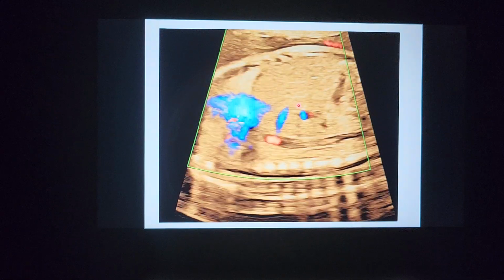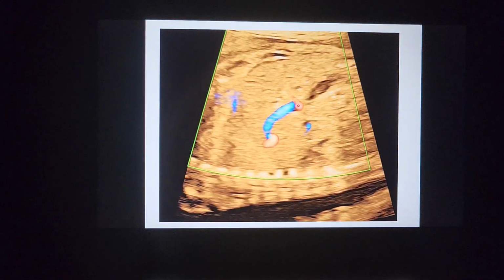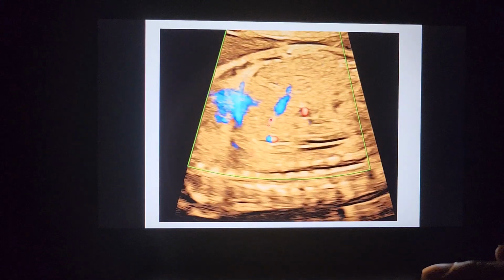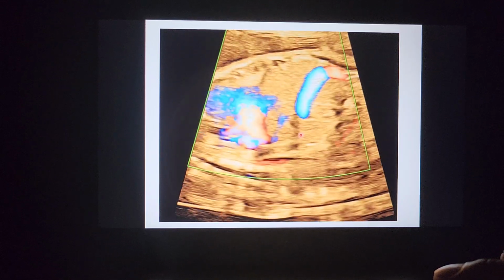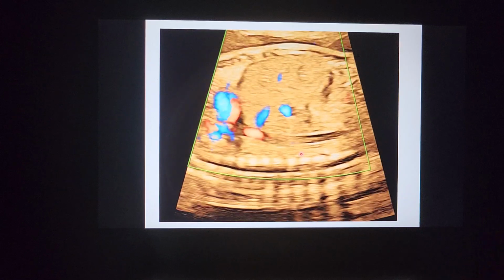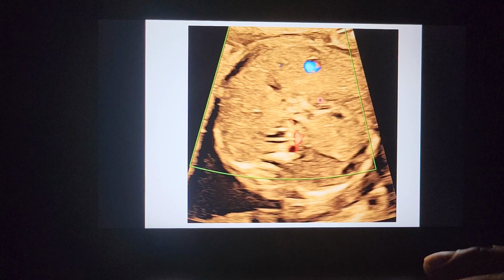And then what happens? You search what is happening. You move your probe to the left and right, then you see this abnormal shunt going from right portal vein into right hepatic vein. In a sagittal view, it is difficult to understand how I have told this as right portal vein into right hepatic vein, but in this axial view you will clearly understand the anatomy.